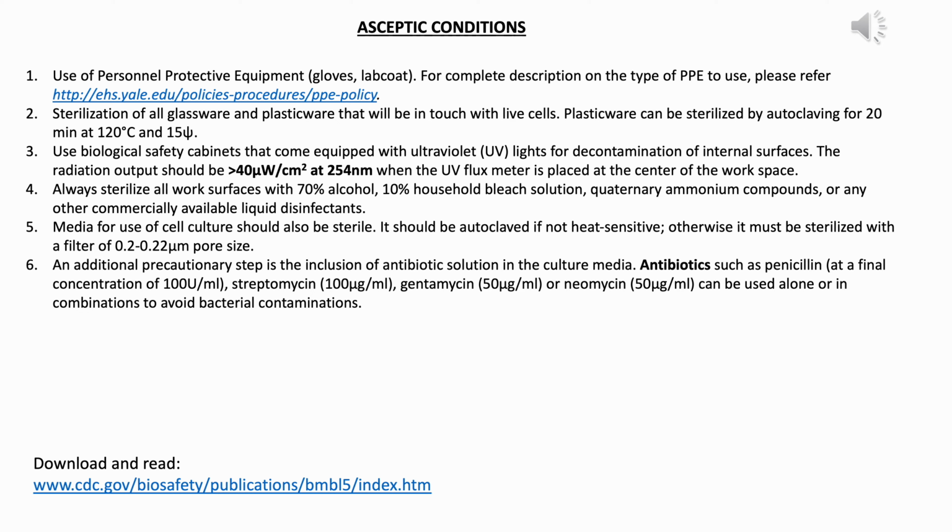One should use disposable plasticware, so that way one can avoid the puncturing of oneself with broken glass, for example. And of course, there is no need to autoclave these things. One can purchase them in sterile format, or one can autoclave them if you purchase in bulk. But of course, there is a high environmental footprint when you use disposable plasticware. For glassware and other things, sterilization one can do by autoclaving followed by dry heat. Dry heat is generally 2 hours at 160 degrees centigrade.